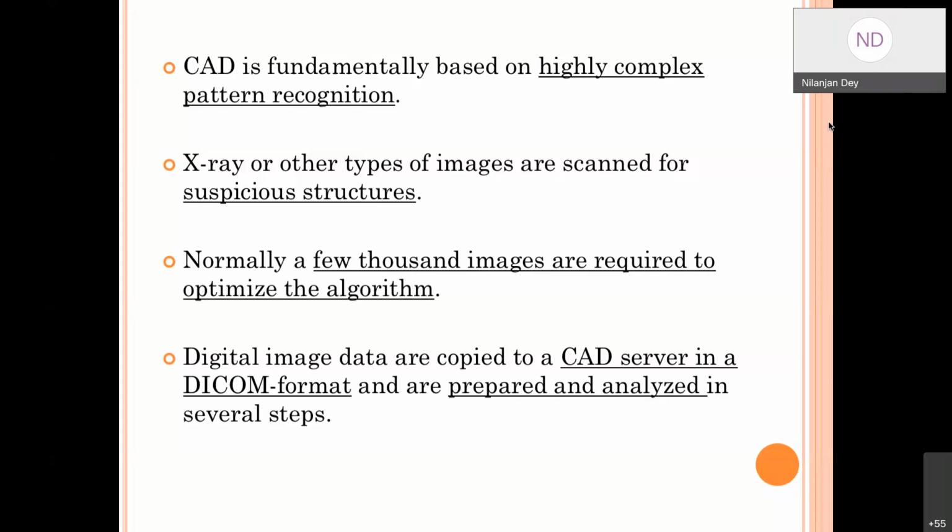But if you have DICOM images, you are lucky because they carry lots of storage space and the quality of the image is very good. So you need not go for any kind of pre-processing. Once you have non-DICOM images, you need certain techniques which enhance the quality of the image. Those demand pre-processing. So initially, from the shallow machine learning point of view, not the deep learning view, the basic step is pre-processing, because as I said, most radiological images are perturbed, noisy, dark and not quality enhanced; the brightness level is poor and the contrast level is poor. So you need to enhance the quality.